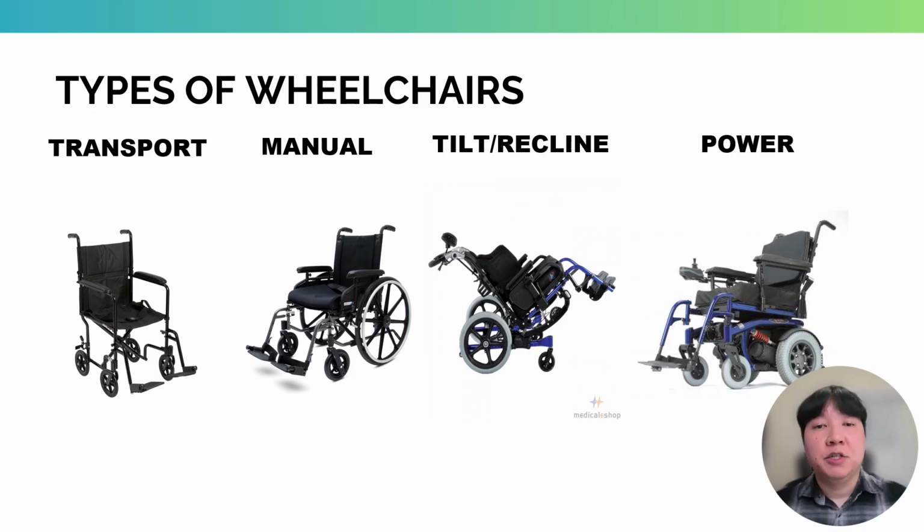Finally, a power wheelchair is a mobility device that is operated and controlled by a client, usually with a custom control option such as a joystick that the client can access. Unlike the previous wheelchairs, its wheels are motorized. The wheelchair features such as the backrest, seating, and footrests are also highly customizable. Clients who use the power wheelchair must also have the cognitive ability to control it safely in their environments.